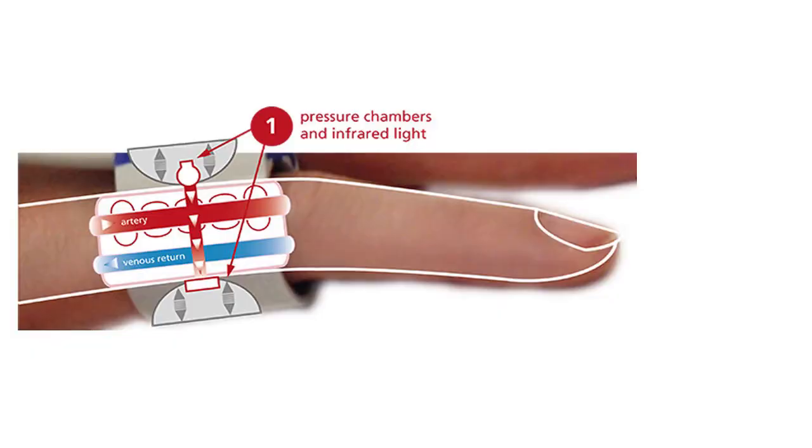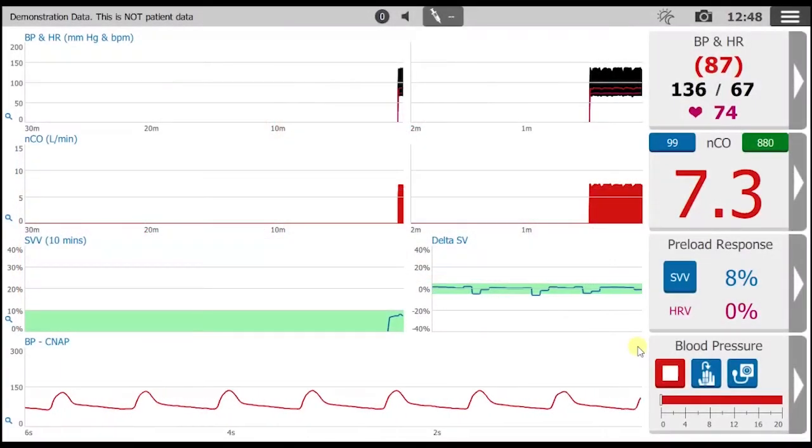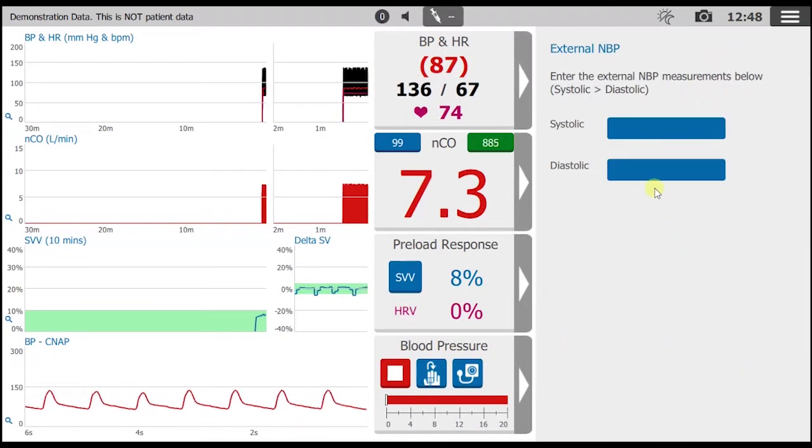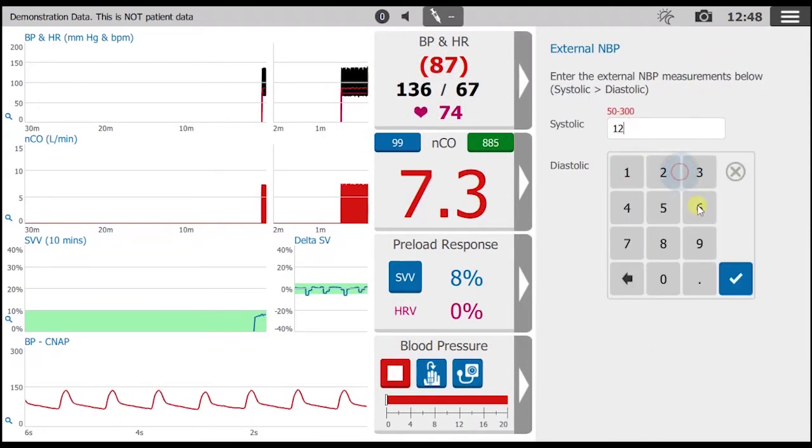The patient will feel a continuous gentle counter pulsation on one finger. And for safety, the cuffs will alternate fingers at designated intervals. The arterial waveform that's created is scaled to values obtained from a recent brachial cuff measurement.